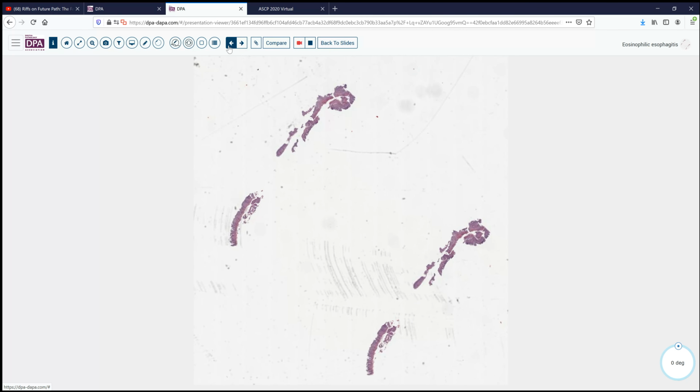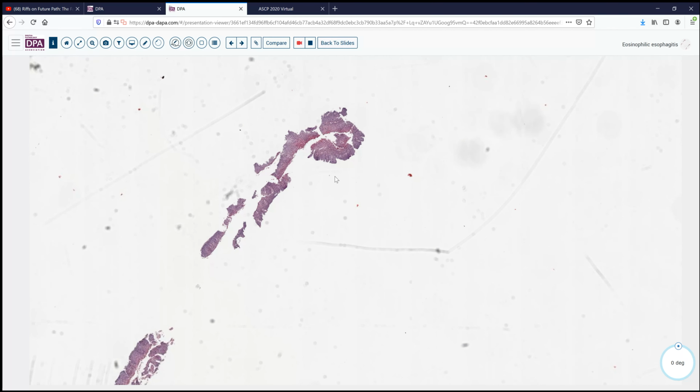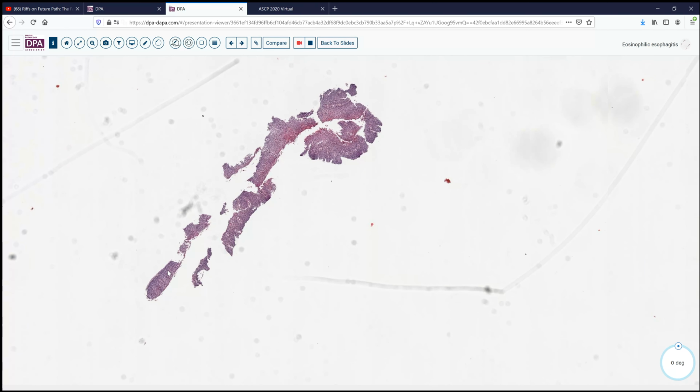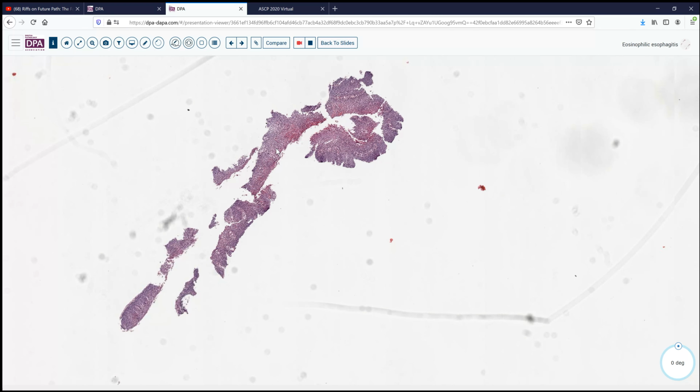The endoscopist took a couple of biopsies from the mid portion of the esophagus. Ideally in this disorder we get biopsies from several levels, but they provided this appearance here, and as we can see, this is rather a bluish biopsy that's not quite as pink as usual normal squamous epithelium in the esophagus would appear. And we can also see that there are some white spaces in between the cells, so there's some evidence here that we've got interstitial edema that's highlighting each of these individual keratinocytes of the esophagus.